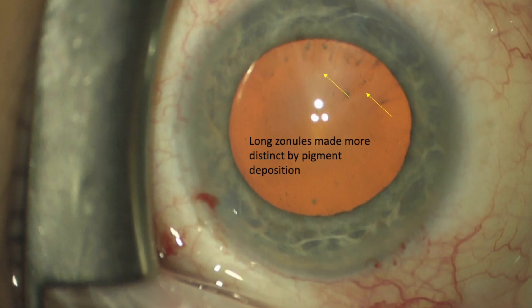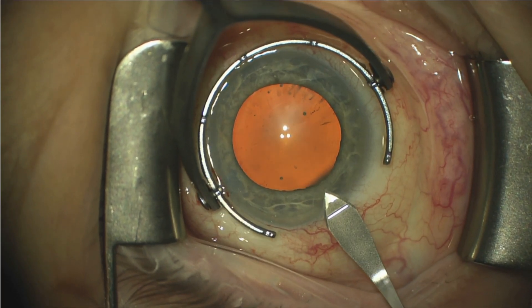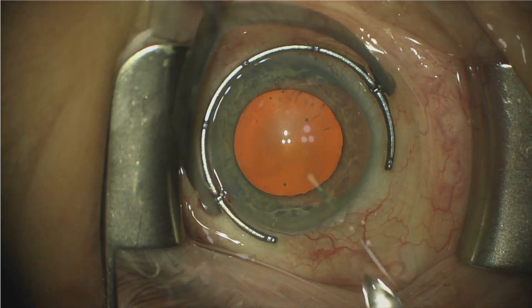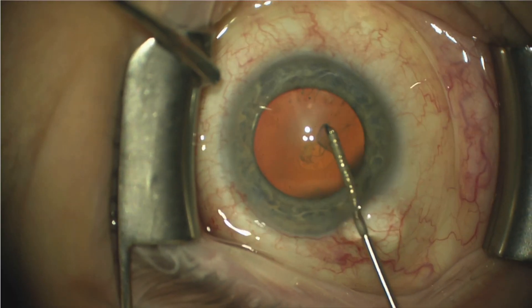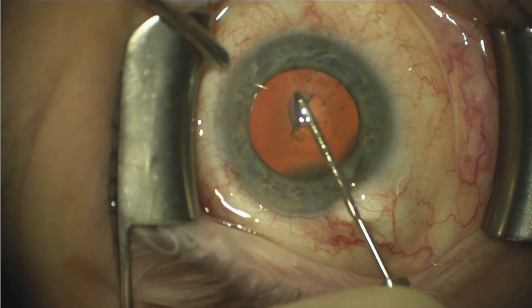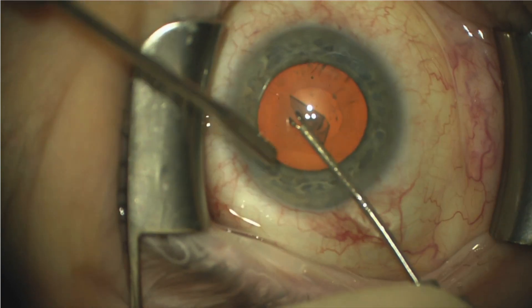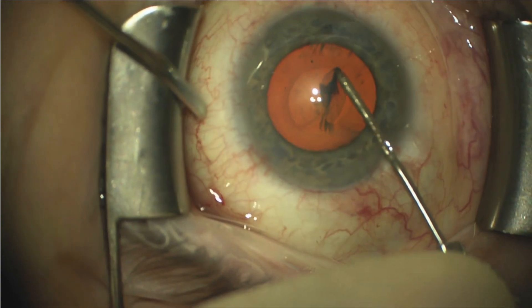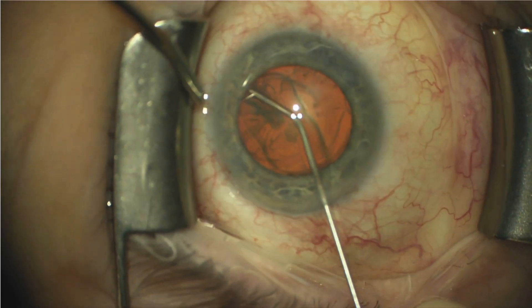A 2.4 mm keratome blade is then used to create a clear corneal incision, followed by creation of a capsulorrhexis with a cystotome and duet forceps. This is sped up, but the key point here is frequent re-grasping of the anterior capsule and making sure that we don't direct the leading edge into the zonule.